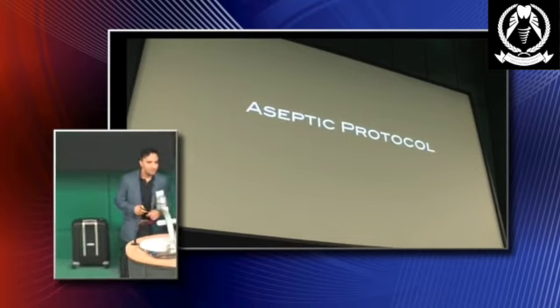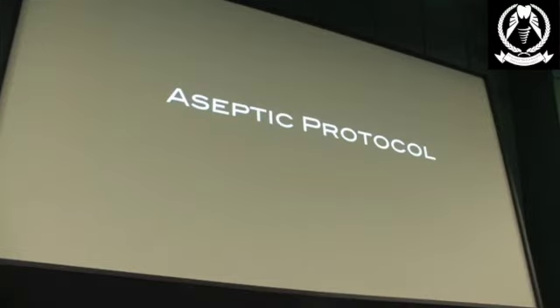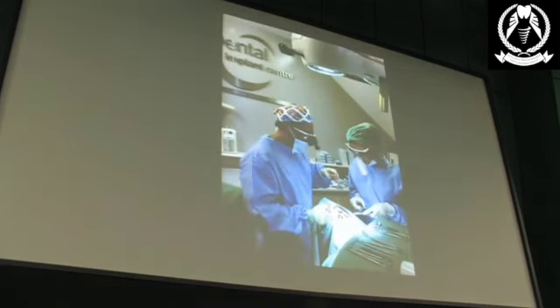Aseptic protocol. So those of you who love oral surgery and things like that might like what's involved in implant dentistry. Because in implant dentistry, we use an aseptic protocol. We get draped up like surgeons do as if you were doing any operation in the body. We use iodine, we disinfect our patients. And the very observant is my assistant is here today, who is in this picture. Zara, where are you? Zara was assisting me in a case in Reading. But this is generally how we operate.